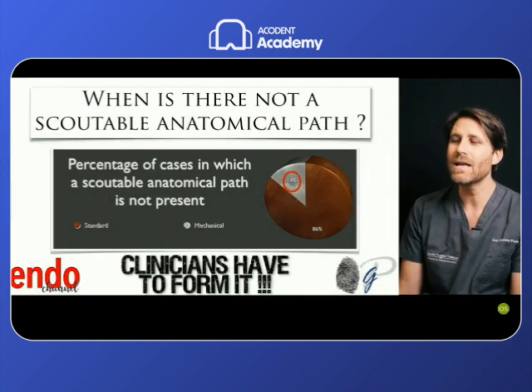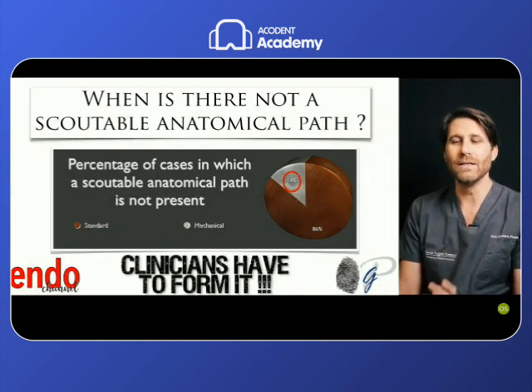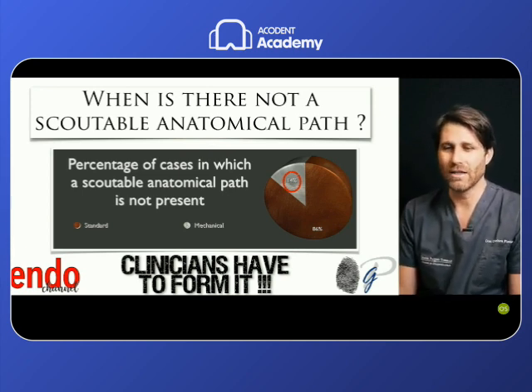Because in this case, clinicians have to form this glide path and to form the anatomical path with some different strategies.